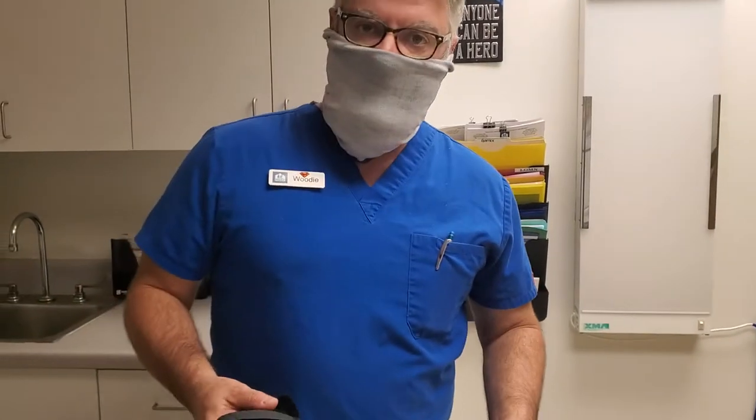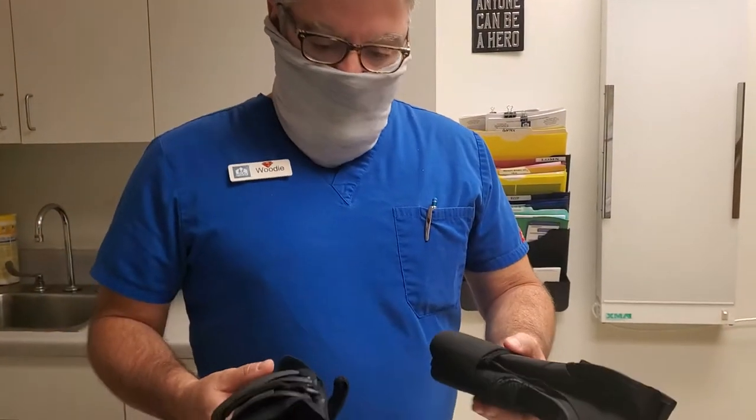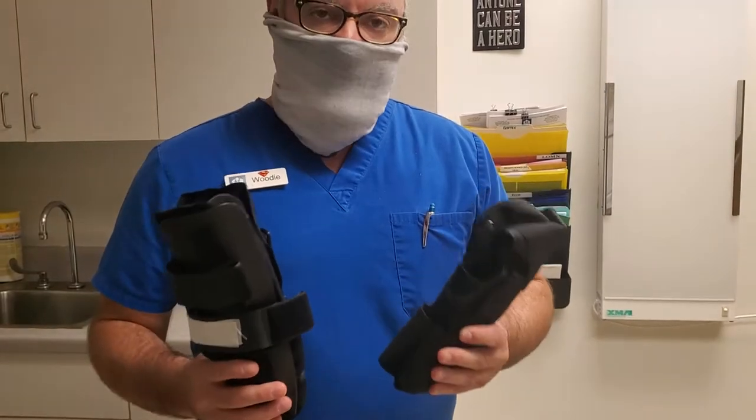Hey everybody, how you doing? Welcome back. Today we're going to be doing a short little video on how to apply an ankle brace.